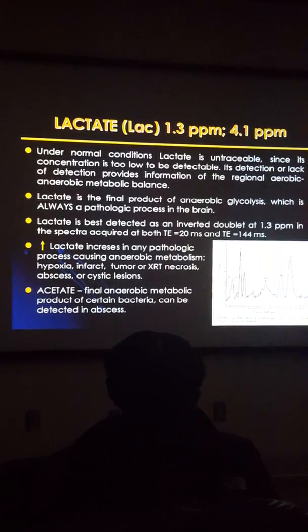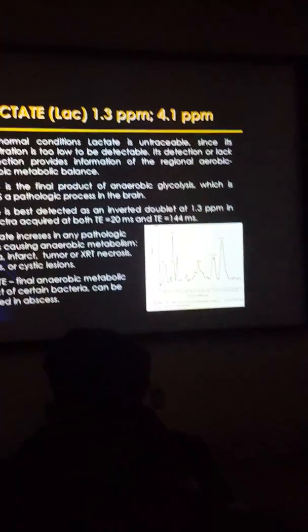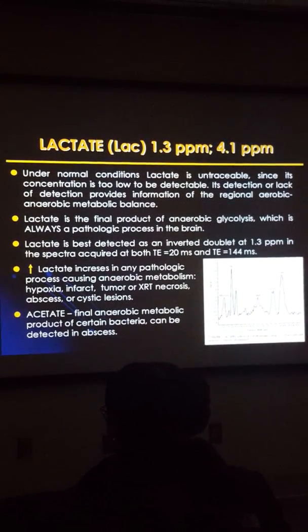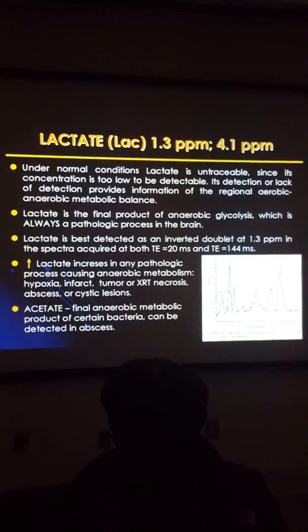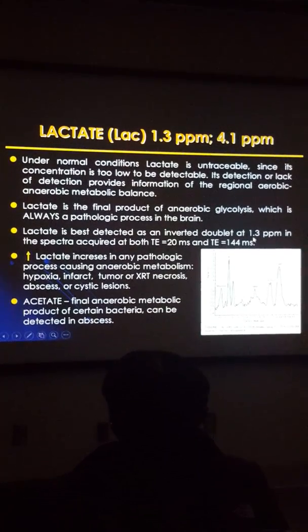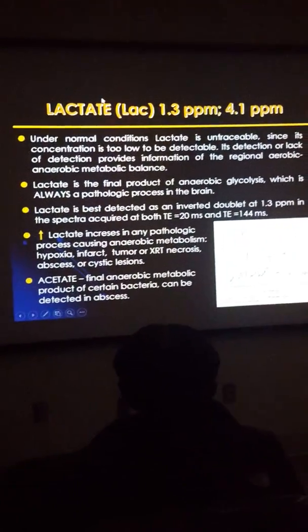If you only remember one thing out of this stuff, it's this, okay? Choline is the marker for aggressive cell membrane production, which typically is going to correlate with aggressive tumors, okay? Cell membrane destruction and necrosis, lactate.